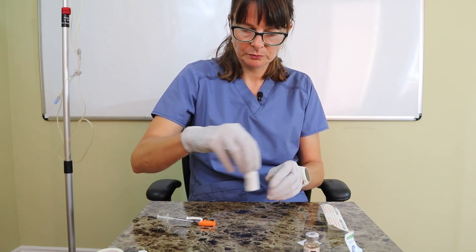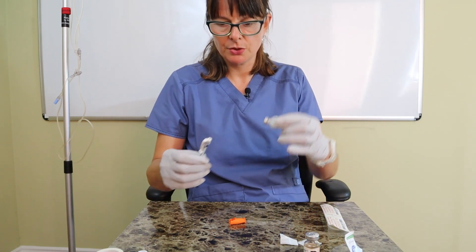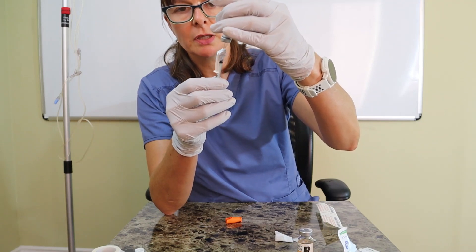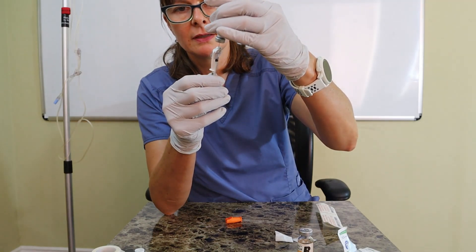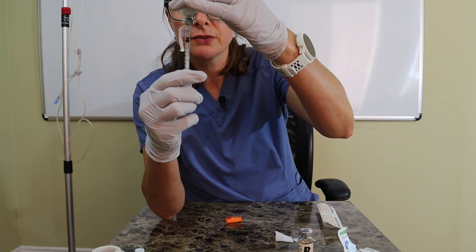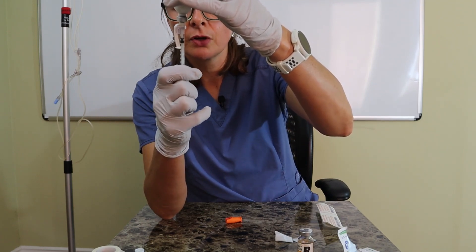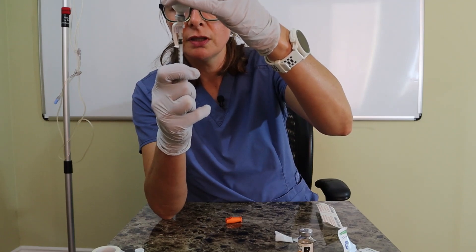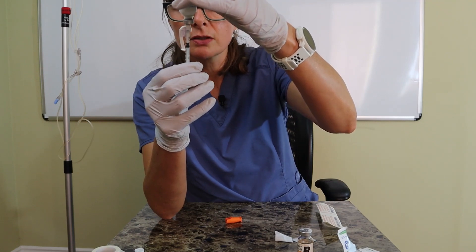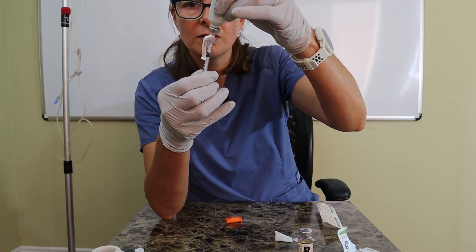Now I'm ready to withdraw my 10 units of NPH. No additional air is needed since I've already done that. I carefully insert the needle and slowly withdraw the 10 additional units, bringing the total to 15 units on the syringe. I'm at 15 and I don't see an air bubble, so I withdraw my needle.